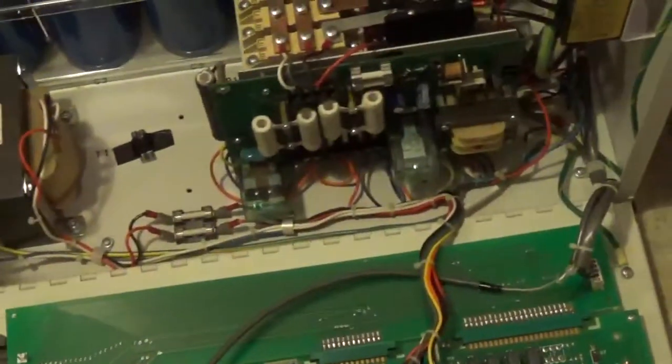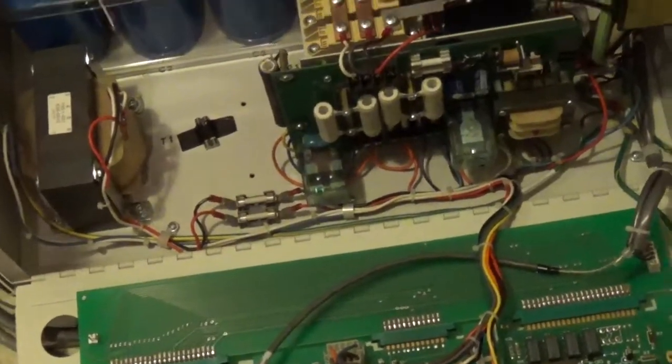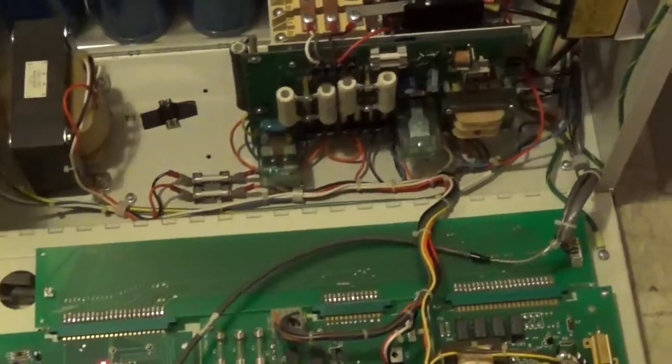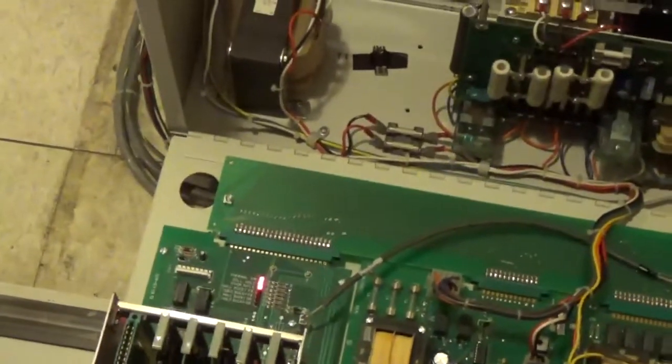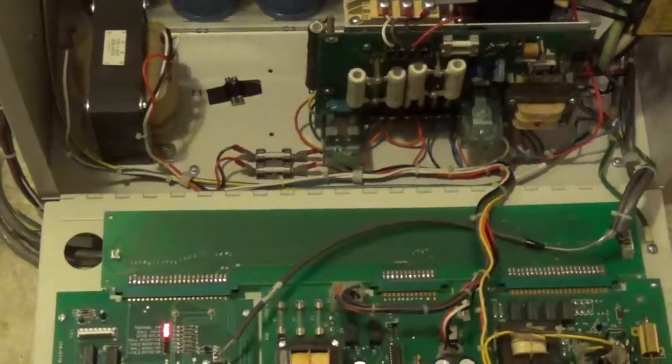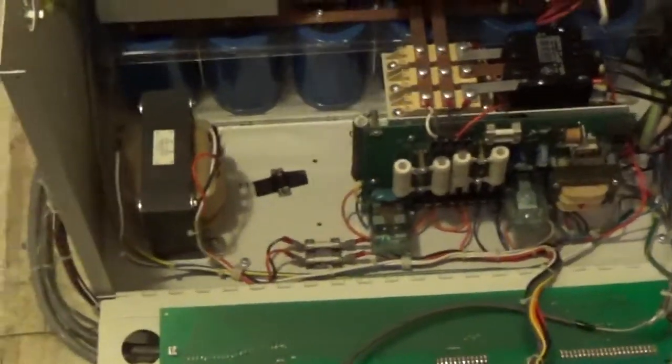Exactly. CPIs do that too. So do the GTRs. They all do that now. GTR does now? Mm-hmm. They didn't. Yeah, they do. The smaller ones do, like the P300s and P400s. Anything above that, though, is three-phase only.